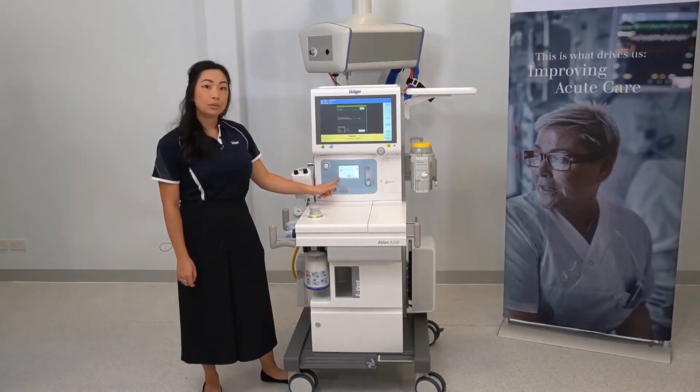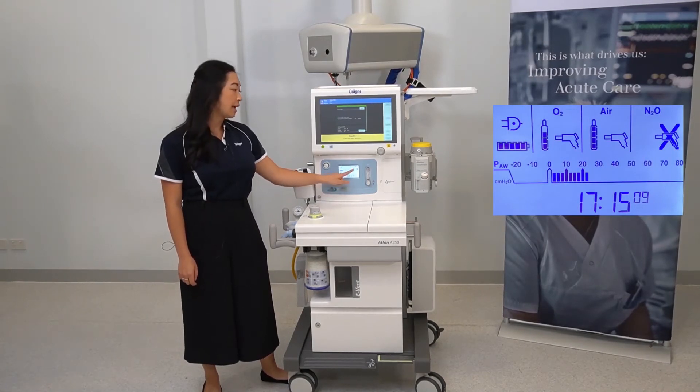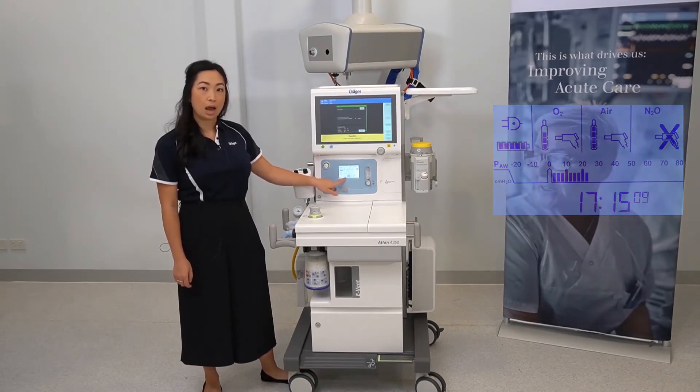This screen will give you an indication of your power supply, your gas supply, has an electronic airway pressure gauge, and your time.